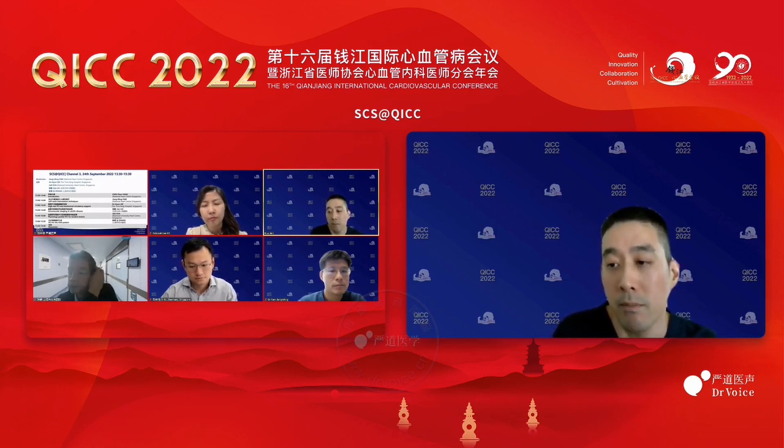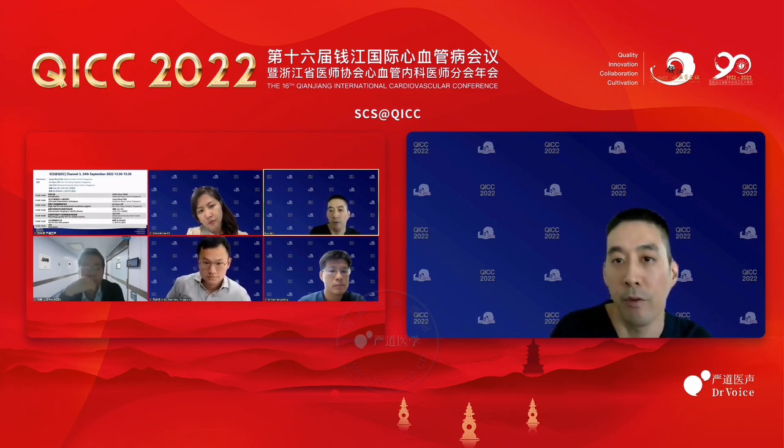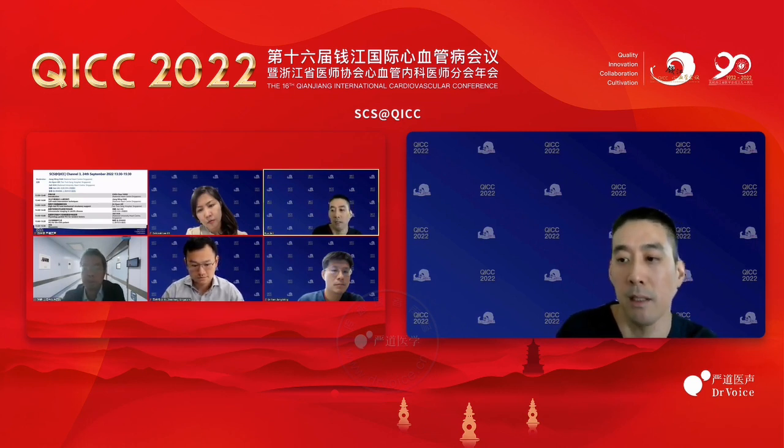But I think the general rule of thumb is that if both are normal, then definitely the long-term prognosis is good. If either one is abnormal and the other one is normal, it is still not so bad. If both are abnormal, it's definitely bad. And I do find that the ones that are discordant are usually around the borderline range. You very seldom find an FFR of 0.61 and then the RFR is like 0.92.